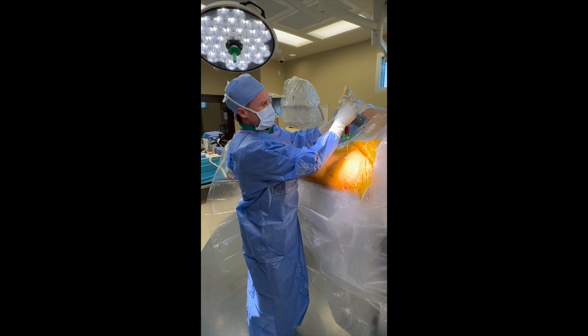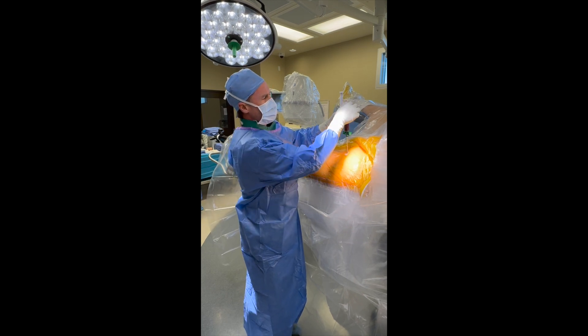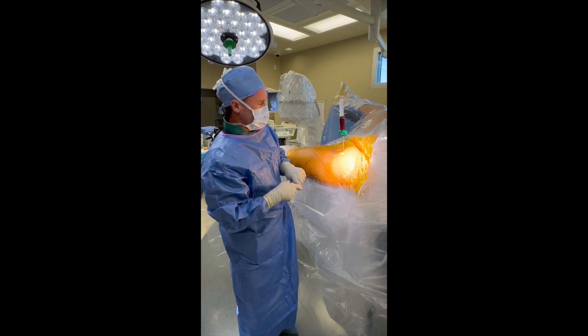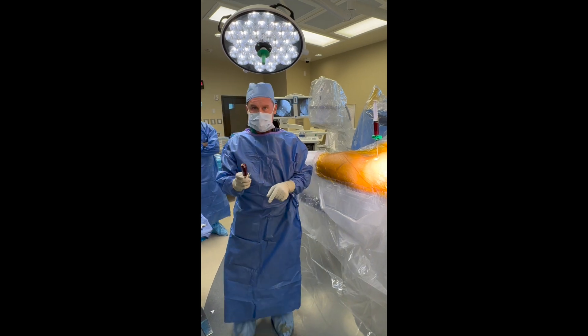This is going to go into the centrifuge, spun down, to give us about four cc's of the mesenchymal stem cells, which are going to be mixed with bone graft and injected into the femoral head as part of the core decompression for this procedure.